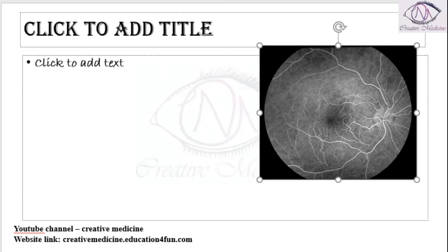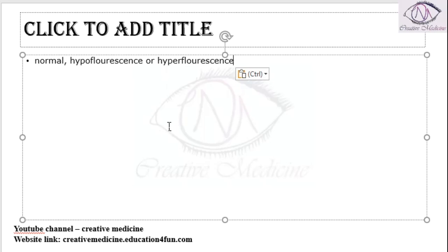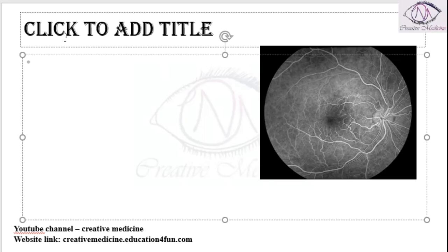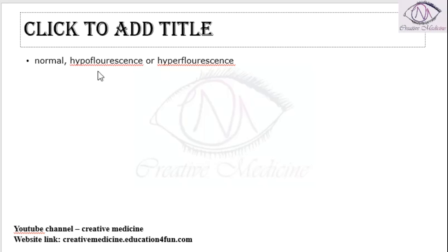Actually, this fundus fluorescein angiography has three phases. The angiography can be either normal, or hypofluorescence, or hyperfluorescence. Actually, this is the normal fundal fluorescein angiography. So this is normal. So there can be hypofluorescence or hyperfluorescence also.